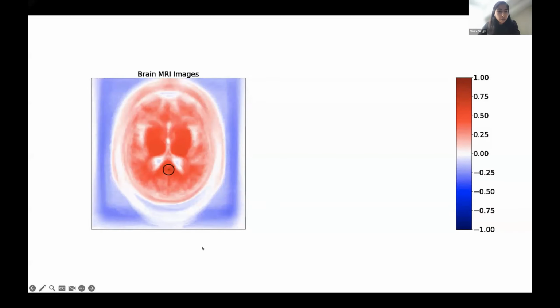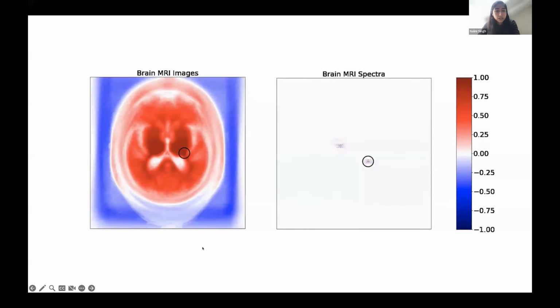So now what we can do is visualize this correlation structure for the corresponding k-space data, which you'll remember is in Fourier space. And probably the first thing that jumps out to you is that there's this rotational symmetry, where we have symmetry at 180 degrees, and there's kind of two blobs that are rotating in tandem with each other. That's actually not what I want to focus on here. That's an artifact of the fact that we're taking Fourier transforms of real valued images.